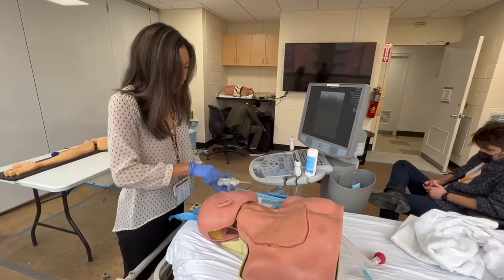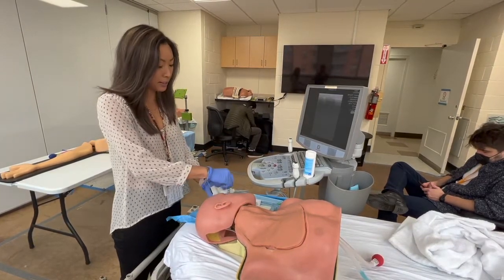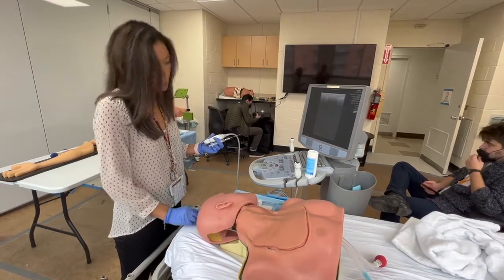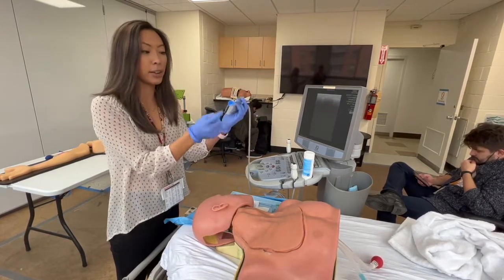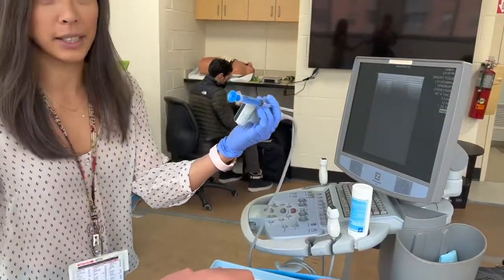In this particular kit, we're using the smaller size cordis. This is the needle that it comes with — it's like the regular central line needle. The bigger one, which might be more useful in actual trauma bleeding situations, has one where you can actually put the wire through the syringe and then remove the whole thing together.